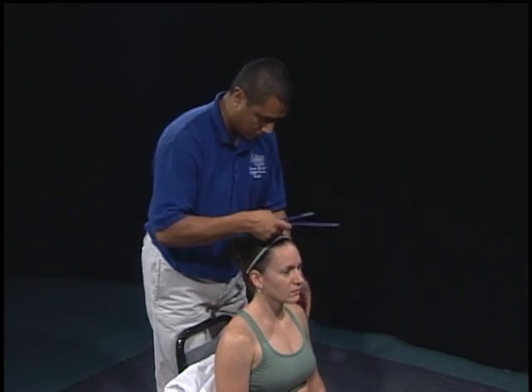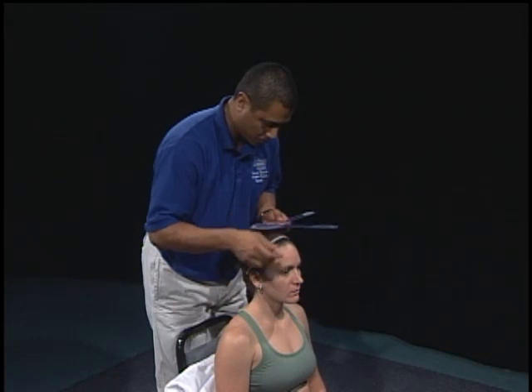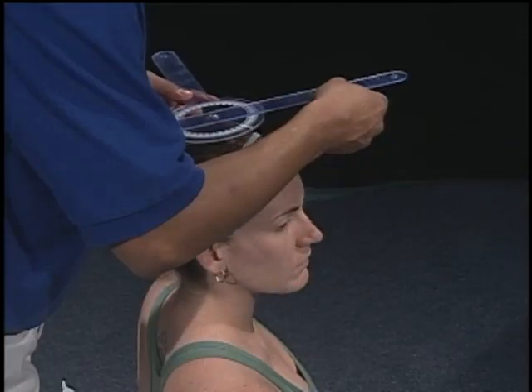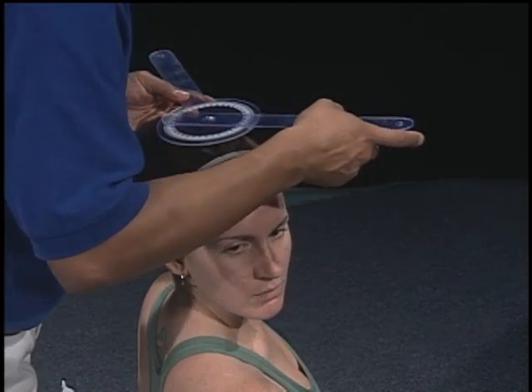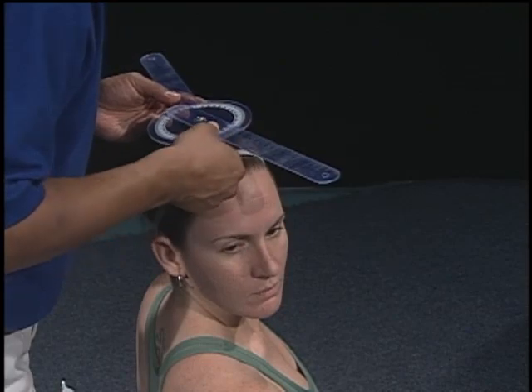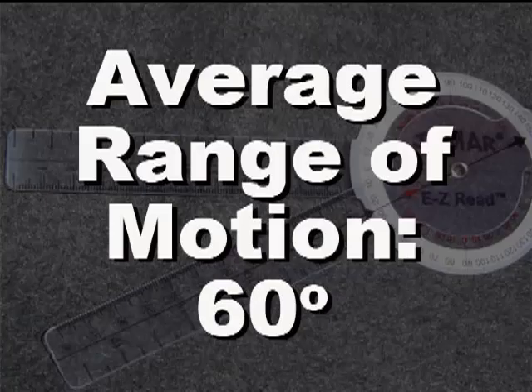Make a note of the amount of degrees measured. Measure twice. If the measurements are off by greater than 5 degrees, take a third measurement. Take the average of the measurements and document it in the patient's chart. Average range of motion according to the American Academy of Orthopaedic Surgeons is 60 degrees.